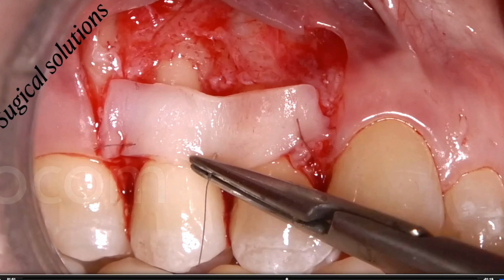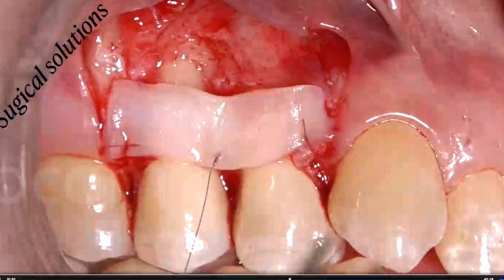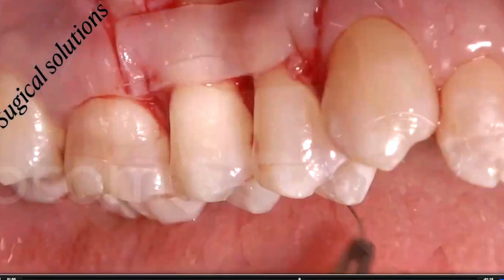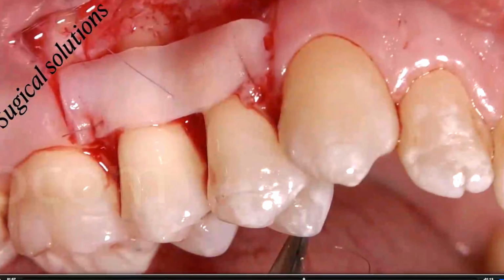So graft, full thickness perforation to the palatal aspect. So you use an 8 millimeter long needle, not 6. Take the suture from the palate, perforate the palatal aspect with the mattress suture. You have to see the needle getting out here at the base of this papilla, just a bit coronal to the graft, so you can close and leave this area completely untouched by the suture.